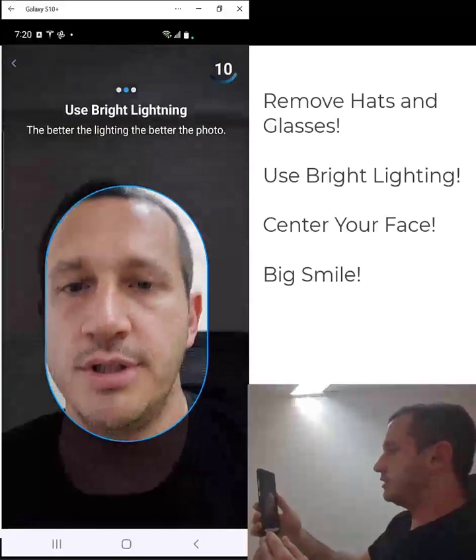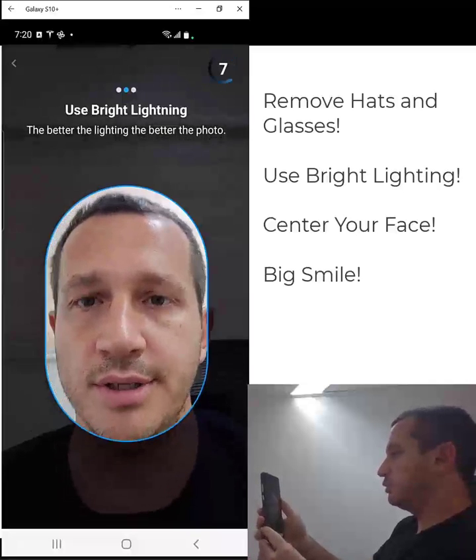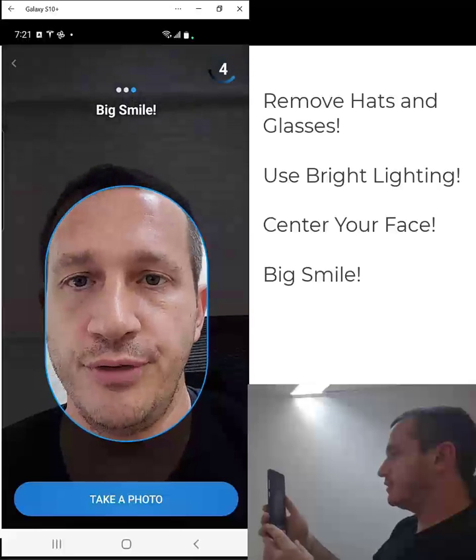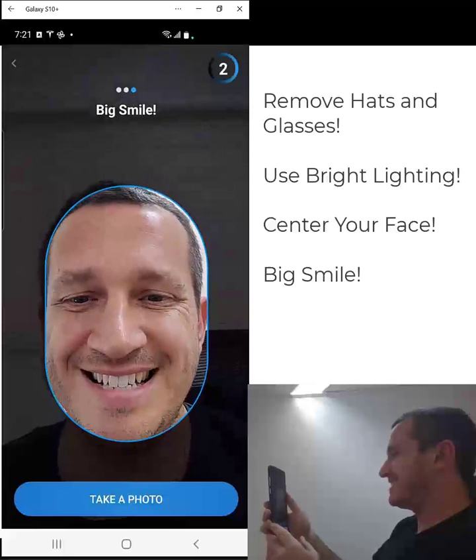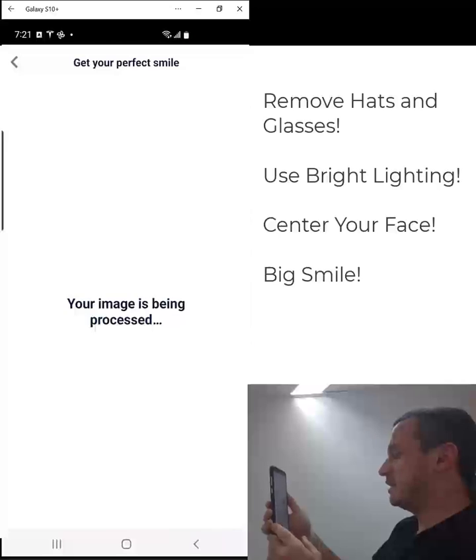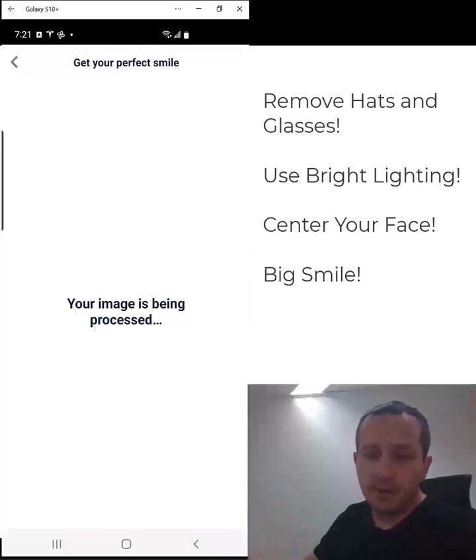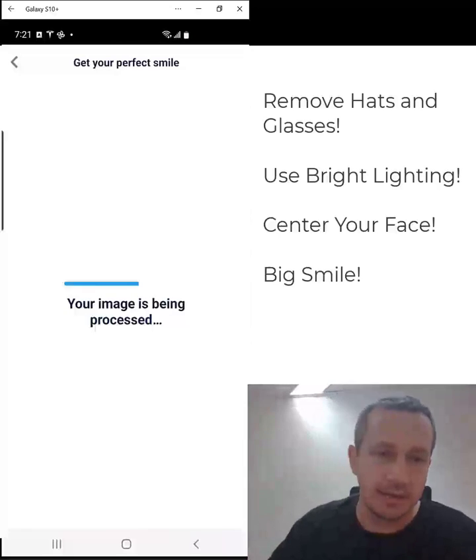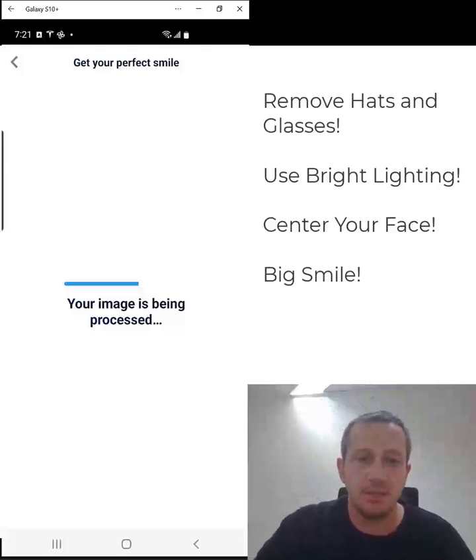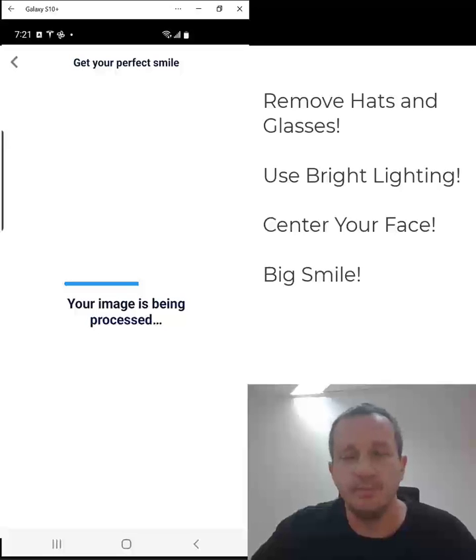Right underneath that, we have start iSmile simulation that you could go ahead and simply click on and use. I'll demonstrate it — simple to use. We have the countdown timer on the top right. Use bright lighting, center your face, big smile. When the timer is up, the photo is taken automatically. It takes around a minute to process the image, so keep the app open during that time.